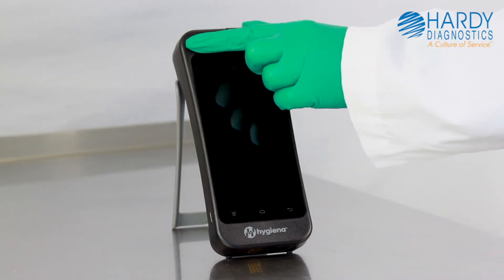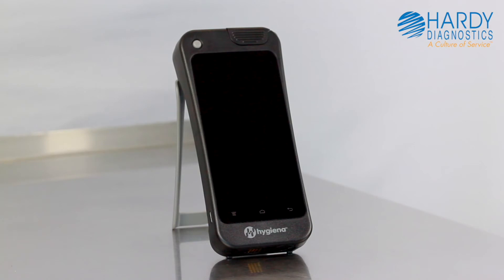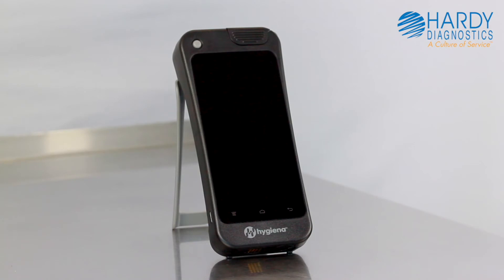To wake it up from sleep mode, simply press and release the power button. It may take one to three seconds to wake up. Be sure not to press the button again during the three second window or you'll put it back to sleep.